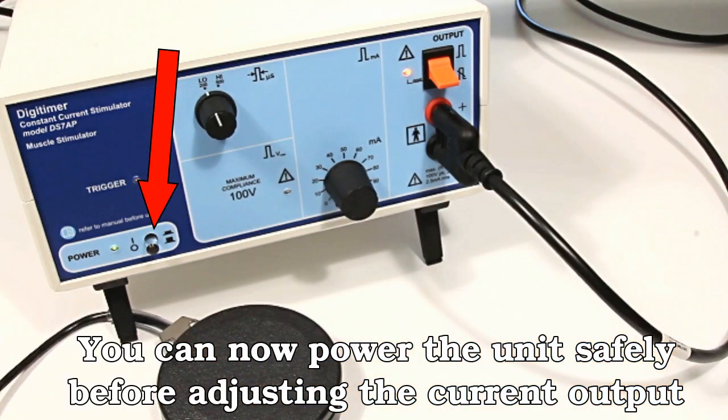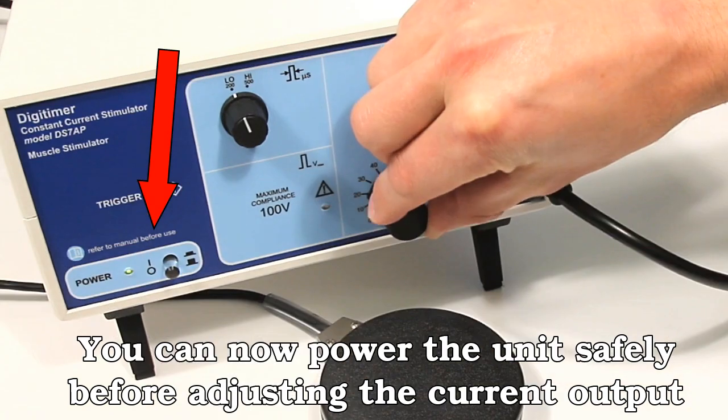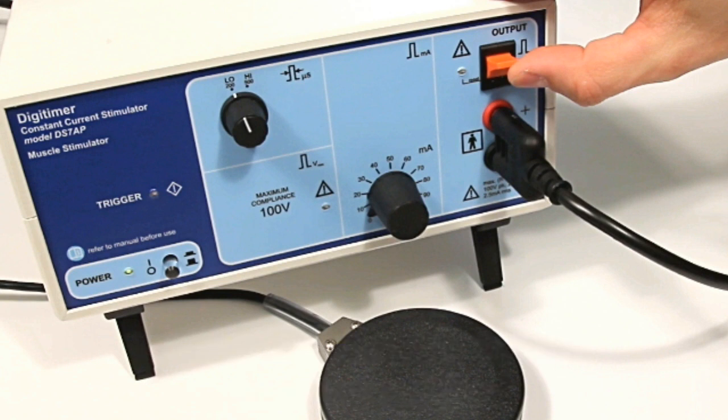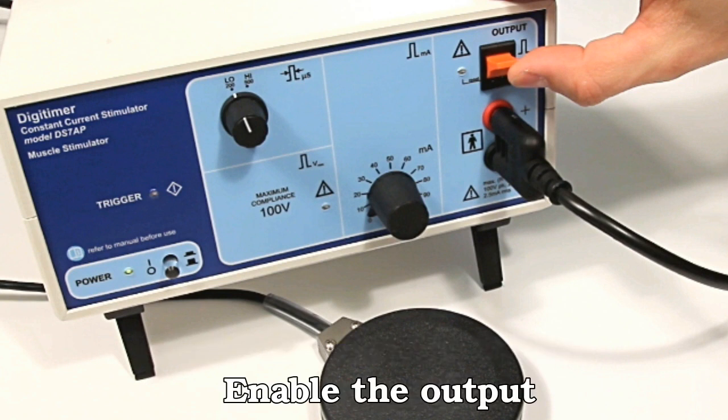Power the stimulator on using the pushrod power switch on the left of the front panel and set the current amplitude dial to 10mA. Next, enable the stimulator output by pushing the orange toggle switch upwards.